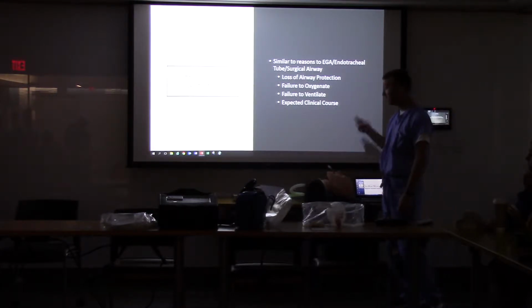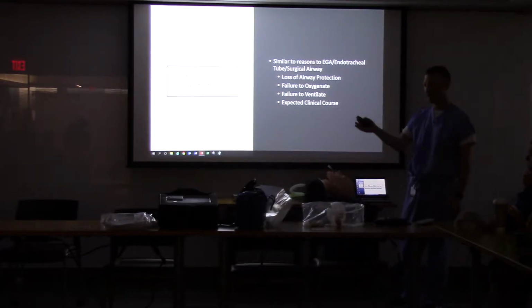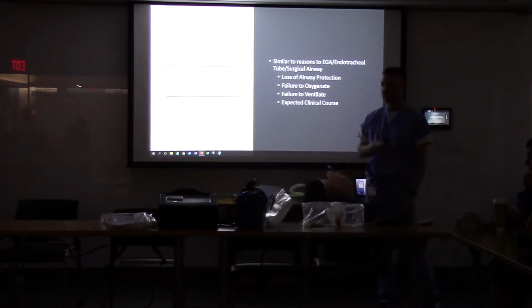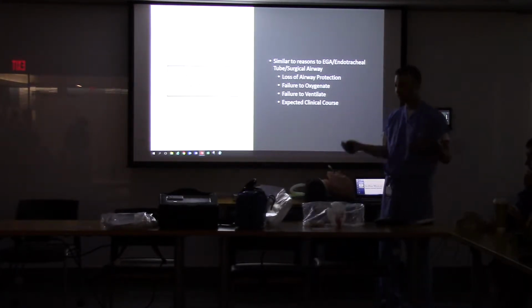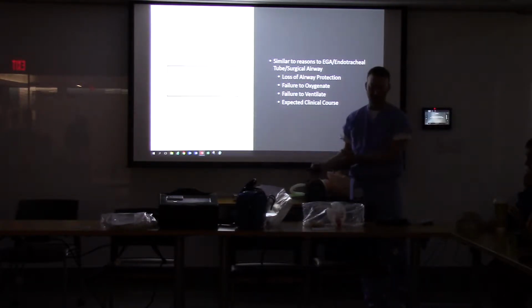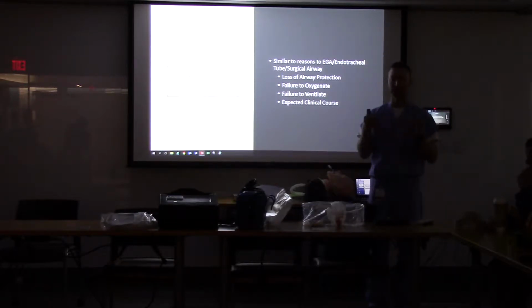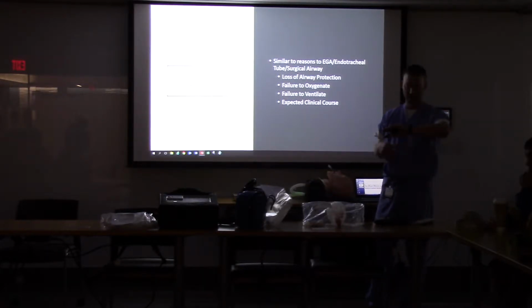And you guys may need to put people on ventilators. We haven't yet gotten enough of these out to the 911 trucks to where you guys have them available, like for the supervisor to show up. But the hope is that in the future, with funding, you can convert a post-cardiac arrest patient or a head injury patient or someone who needs very meticulous mechanical ventilation, as opposed to the lowest trained person squeezing the BVM. You will be able to remove the human factors out of it and start them on mechanical ventilatory support.